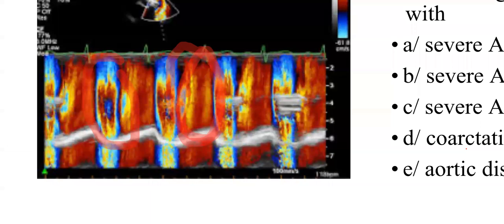This is functional aortic stenosis due to a very large jet of AR going back into the LV, and when it goes during systole, it's beyond the capacity of the orifice. So it creates sort of functional stenosis. Exactly. So that systolic flow acceleration or turbulence is again due to the severe AR. So this is severe AR.